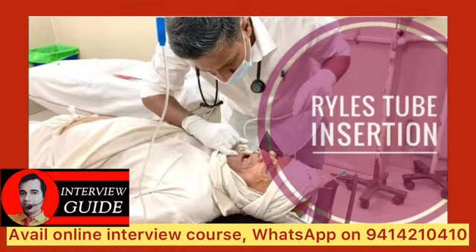Then we have contraindications. Contraindications are alkali and acid poisoning, gastroesophageal reflux disease, stricture in the nostrils, ulcer in the nostril, then fracture base of skull. These are the contraindications. Ryles tube is made up of PVC or silicone.